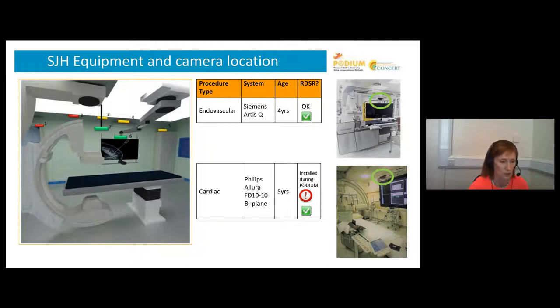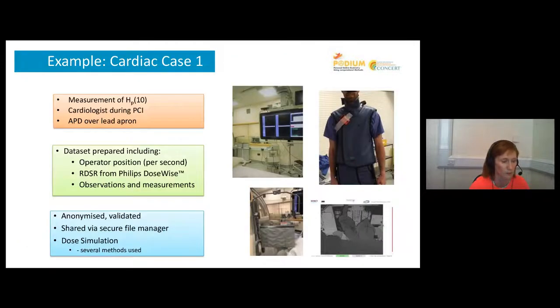So there are the two rooms that were used, and there were very serious discussions about where the best place was to install the camera in those two rooms. If I just give you one example of what would happen when we were tracking a cardiac case, cardiac case number one.